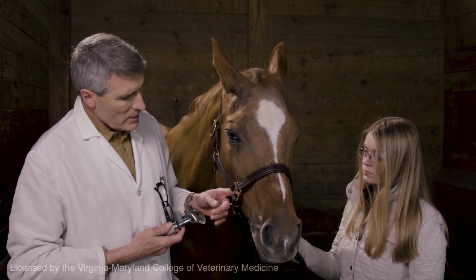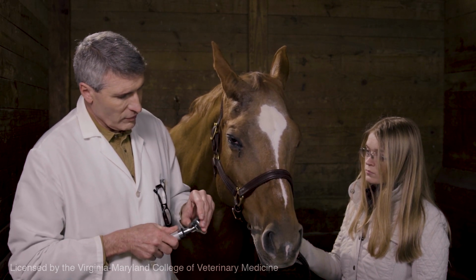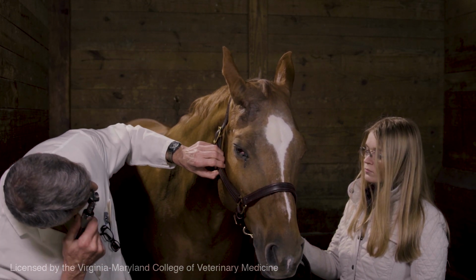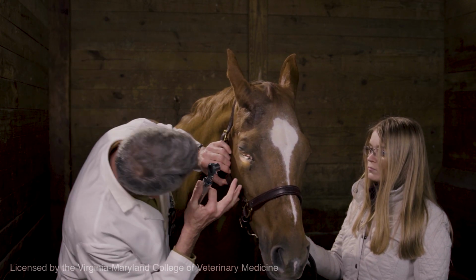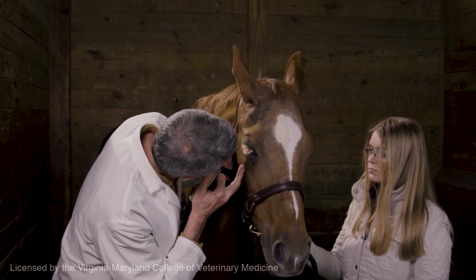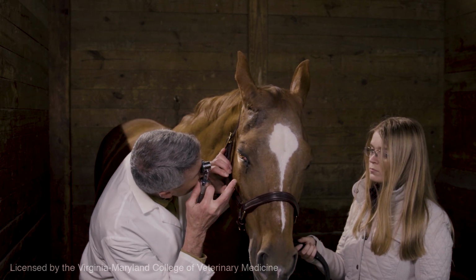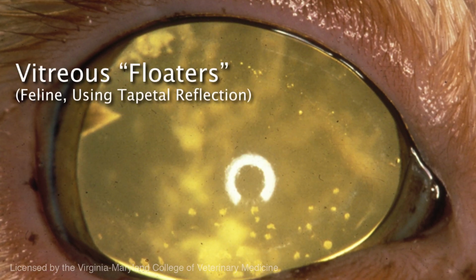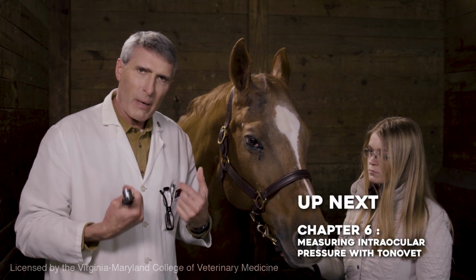So what I would do here is I could turn the ophthalmoscope or the otoscope on and flip the lens out of the way, and I could stand back a couple of feet and get the reflection. Or I could flip the lens in and I could look a little closer, and by moving around I could see if there was any opacity in the lens against that backlighting, or if there was any debris floating around in the vitreous, what we call floaters. And so this is how you would use the process of retroillumination to see things in the front of the eye by them being backlit.